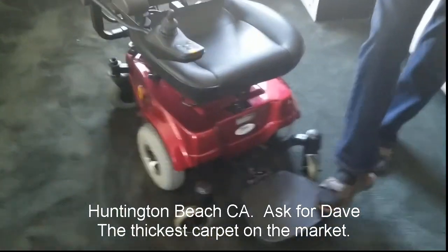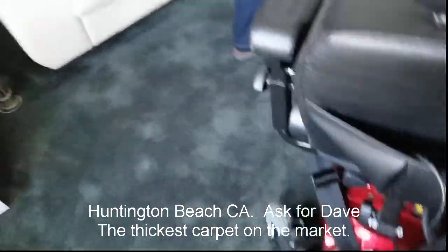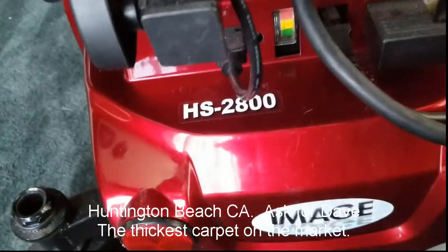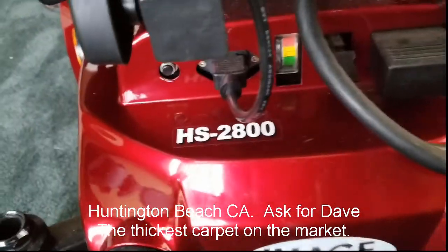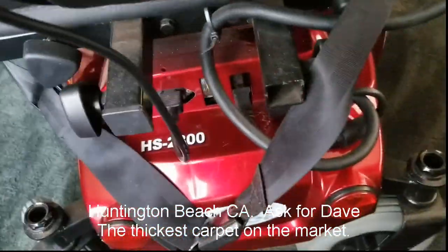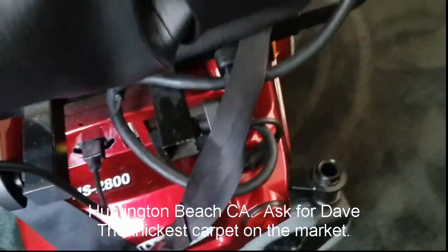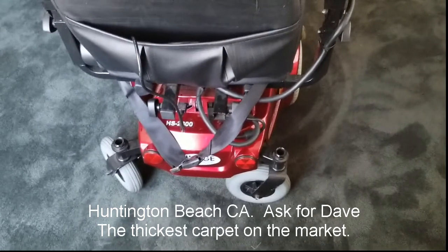Let me get the model number — going to the back, it tells you the name of it. It's an Image, and the model number is HS2800. It's a 10-year-old chair, but it's rarely been used. It's not in mint condition, but I would say it's certainly in good condition. And it's strictly for in-house use.